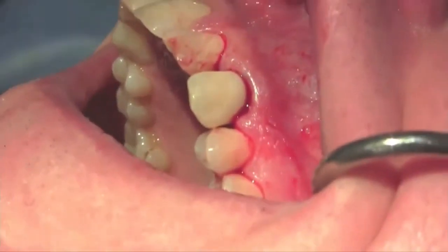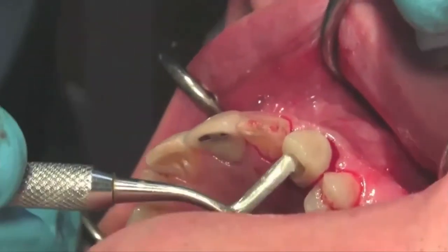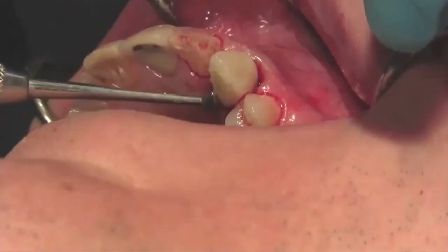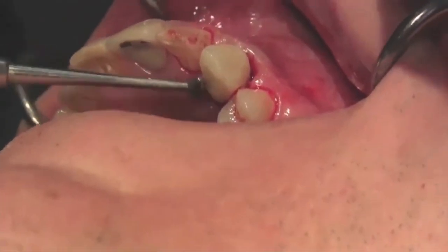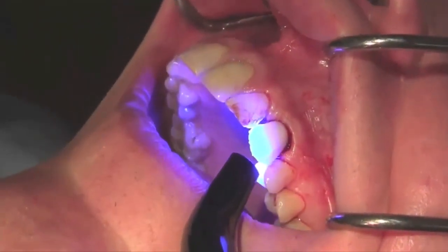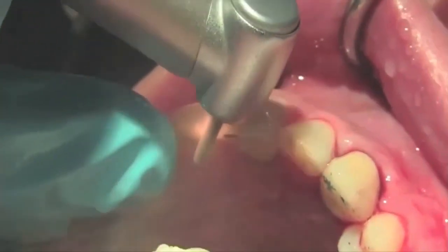We usually don't suture during this kind of procedure. There's really no necessity to suture the site, but you could use probably 6-0 or 7-0 polypropylene if you feel more comfortable with the approximation of the site, but there's no necessity.